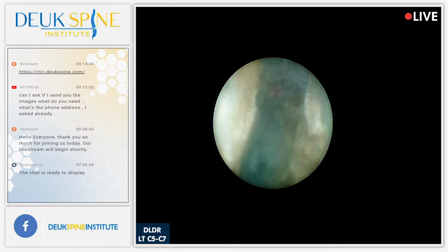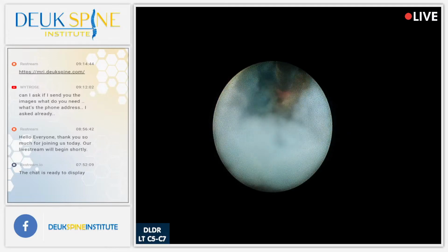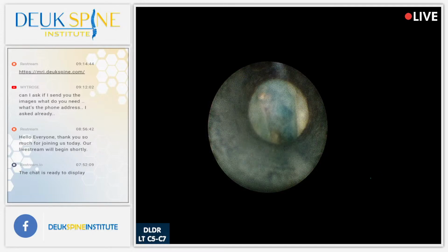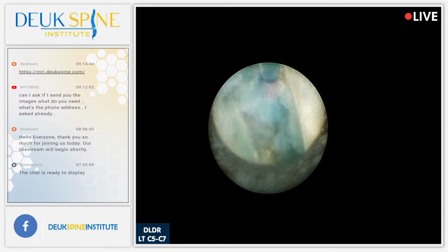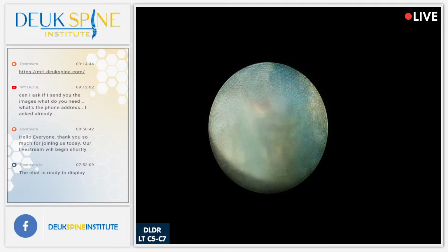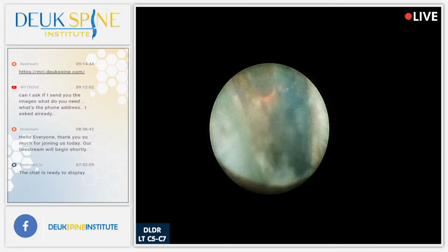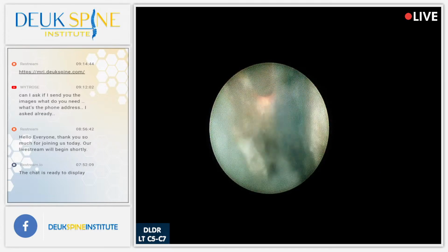Now, a report by itself is not enough. I don't make surgical decisions based on reports because radiologists often miss the cause of people's pain. And that's why there's so many people that have pain, even though they've had an MRI, because the radiologist is missing the source of their pain. And I don't miss the source of people's pain usually. I do a pretty good job at Deuk Spine of figuring out where people's pain is coming from, but it requires that I actually look at the MRI images myself. Most neurosurgeons are trained to look at the MRIs themselves and formulate their own opinions about the cause. That's why we don't just go based on a radiologist report, because there's too much inconsistency with the radiologist.